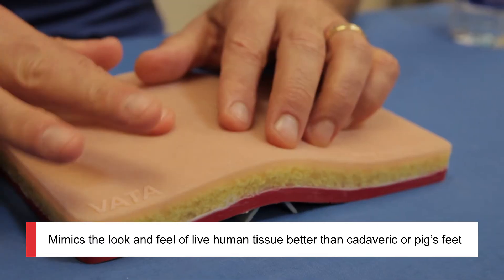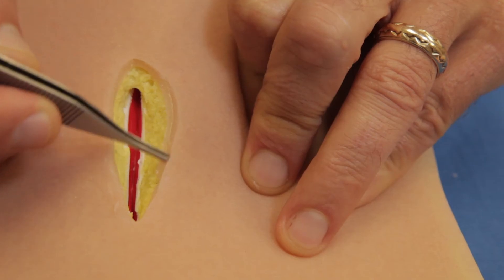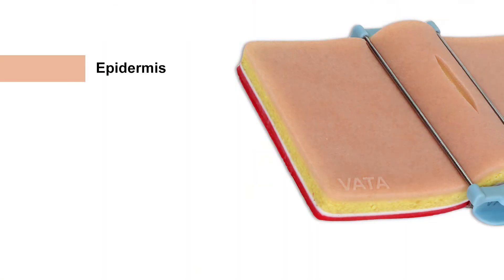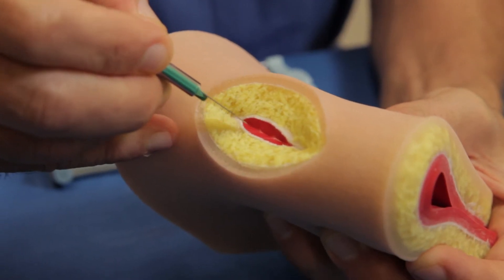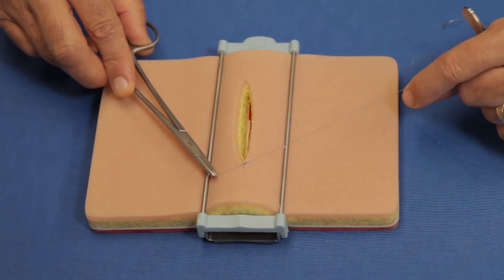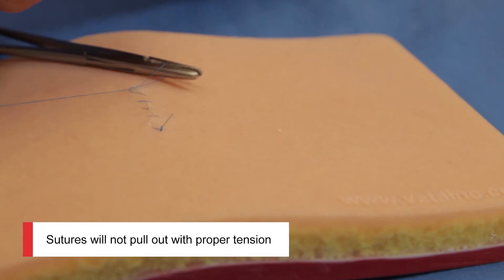Let's start with the suture pad. It's five by eight inches in size, and what you'll notice when you pick this up in your hands is that it's incredibly lifelike and really simulates natural tissue. There are five separate layers: epidermis, dermis, fat, fascia, and muscle. The sutures really hold compared to cheaper plastic and rubber pads, and you can truly practice as if you were suturing natural tissue.